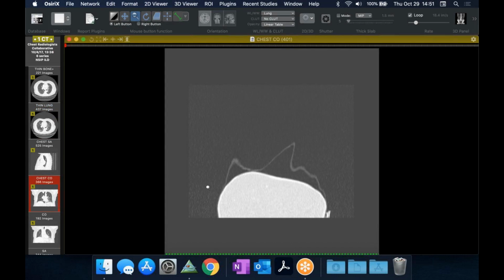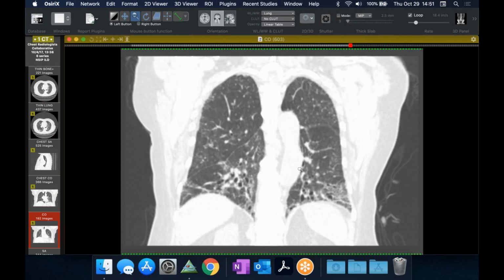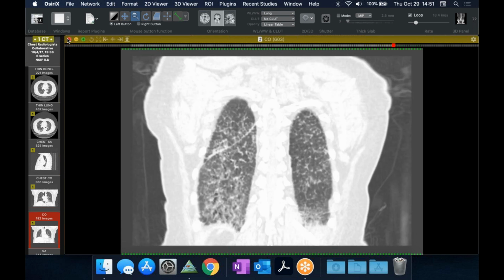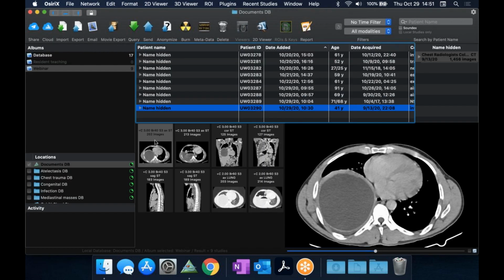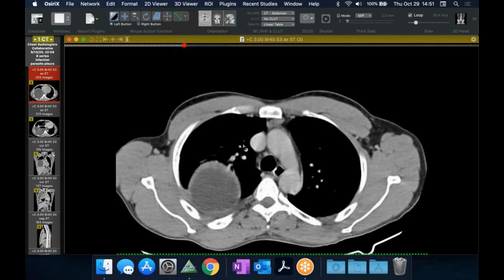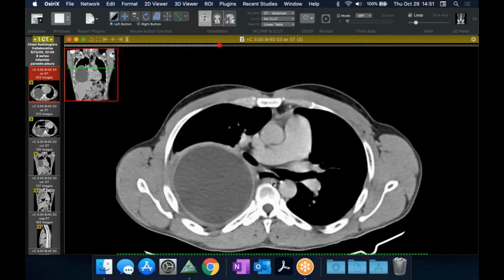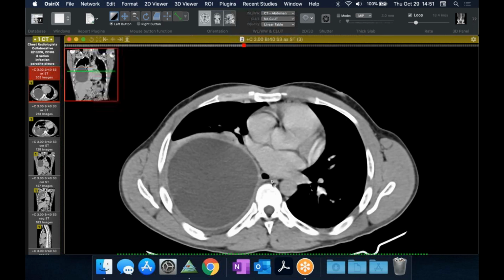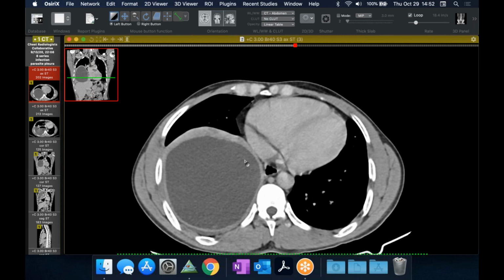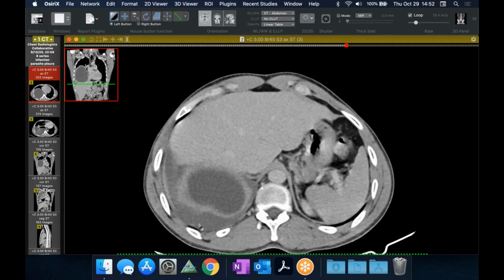But no, he's a non-smoker, doesn't use any illicit drugs or anything like that. He sort of has an allergic phenotype, but just doesn't have asthma or CF, which traditionally are criteria to diagnose ABPA. Right. But yeah, and you're right about the mucus plugs. I have cases where the airways are cleaned out, but they still have the diagnosis. But I think in this case, the dense mucus, if you didn't have a working diagnosis, would really point you to it, or at least to evaluate for it, even though the distribution is kind of upside down. Right. All right. So that was kind of an interesting case. Yeah, it was a fun one.